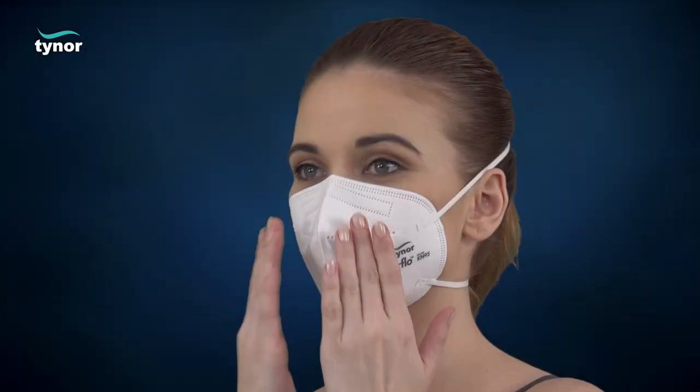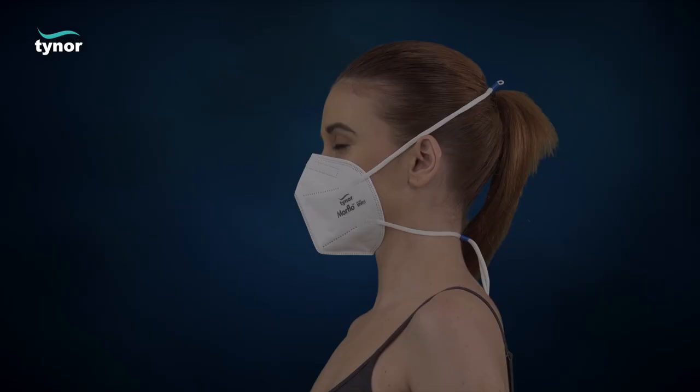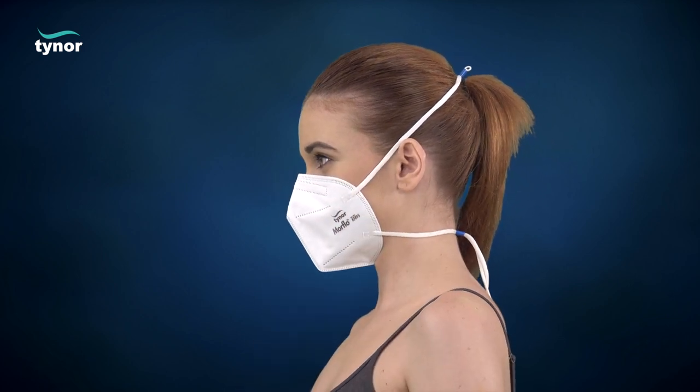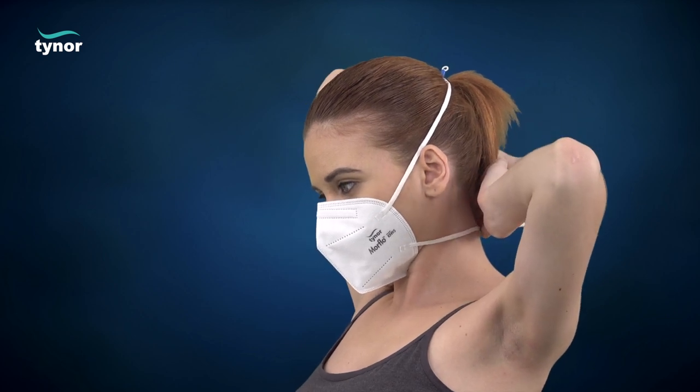To test the mask-to-face seal, perform a user seal check. Place both hands completely over the mask and exhale sharply. Be careful not to disturb the position of the respirator. If air leaks around the nose, readjust the nose clip as described in step 5. If air leaks at the respirator edges, adjust the head straps for correction.